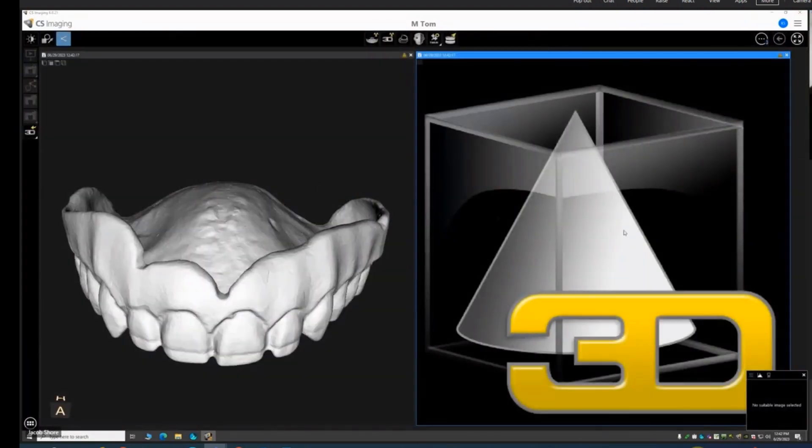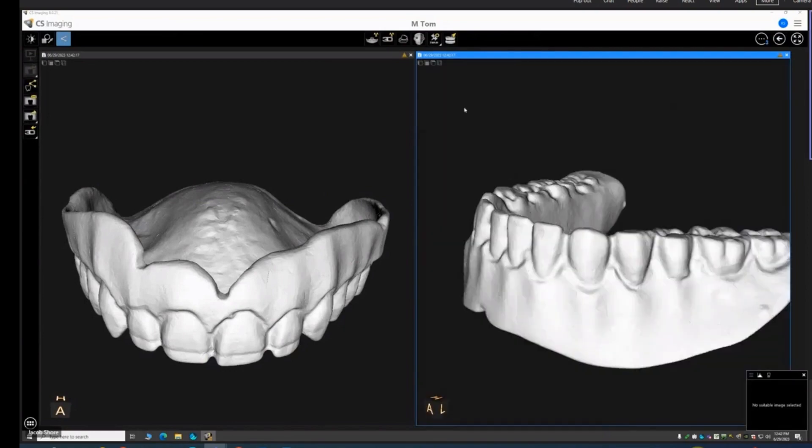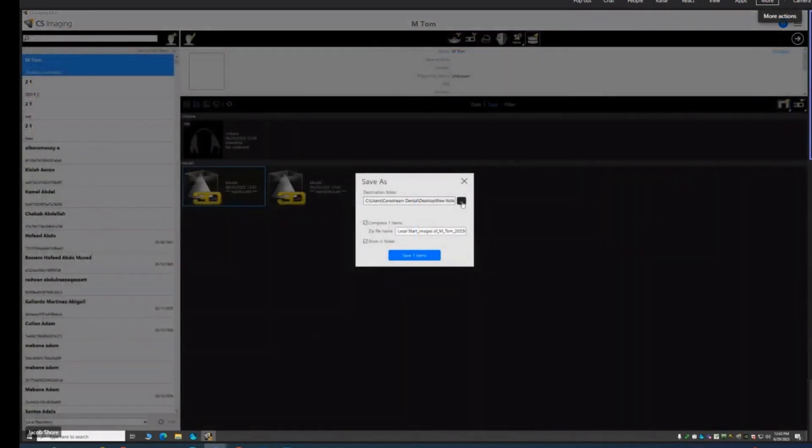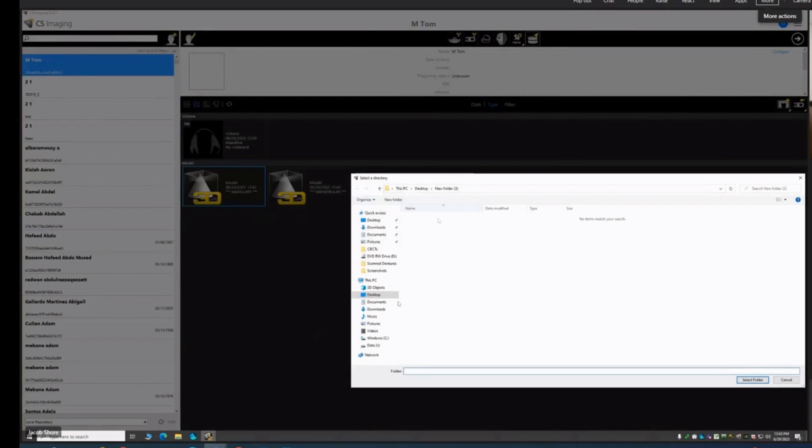When you are satisfied with the scan, you can accept or reject it. If you choose to accept it, the STL files are generated and stored in the patient's chart, labeled with the date and time. To export the files, you can perform a simple basic export.